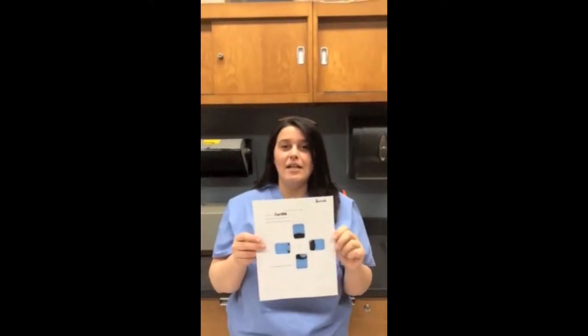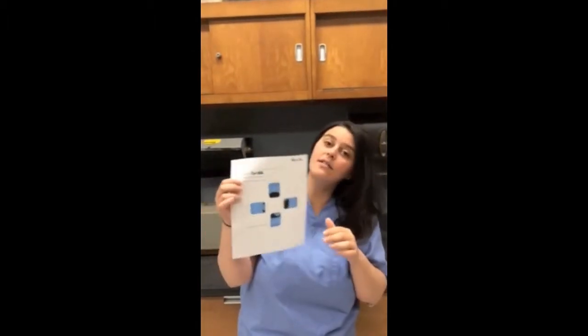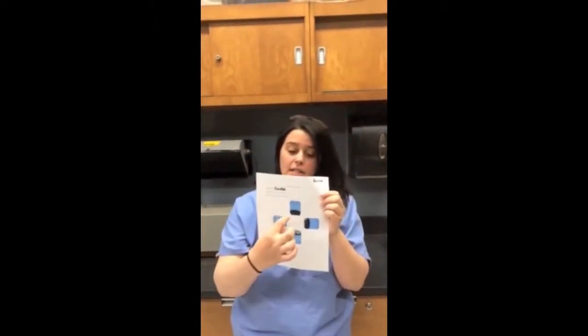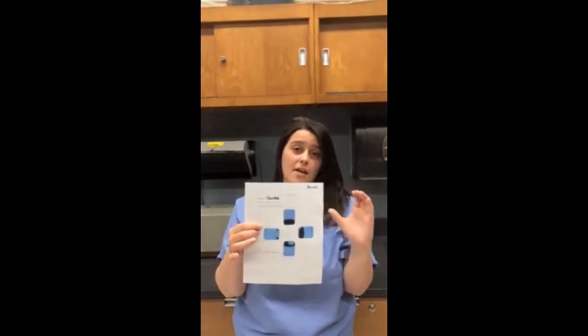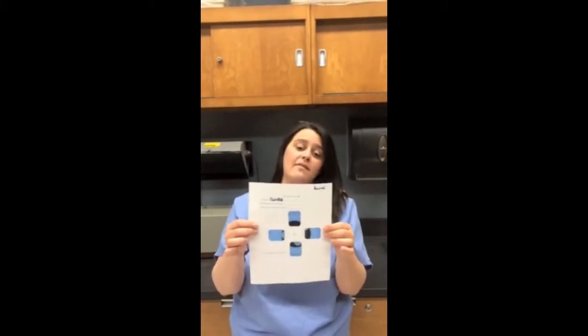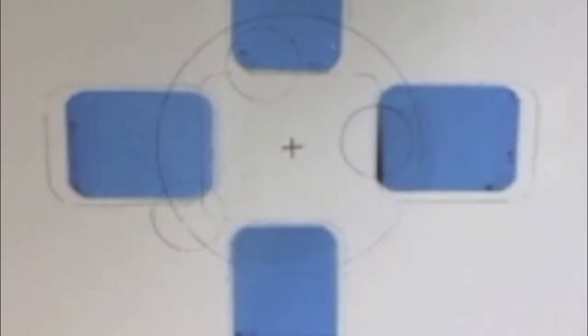Okay, so I exposed these films. They've been developed now, and I used the round collimator. As you can see, it cut off portions of the film, and it reduced the X-ray beam size to the size of the round collimator, which is 2.75 inches, so that's why only a small portion of the film is developed.